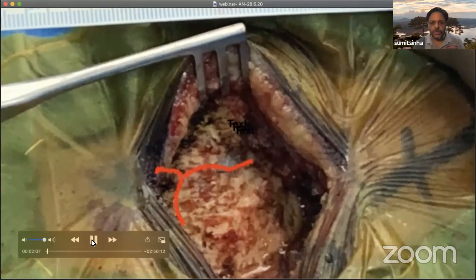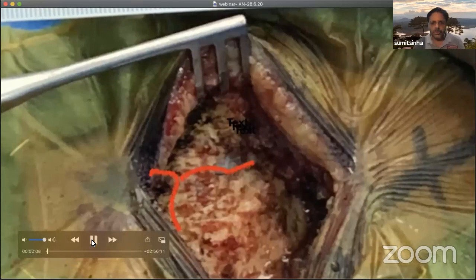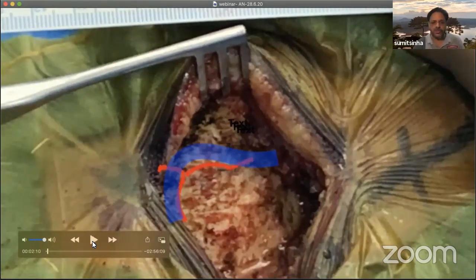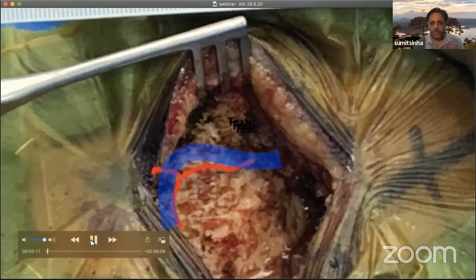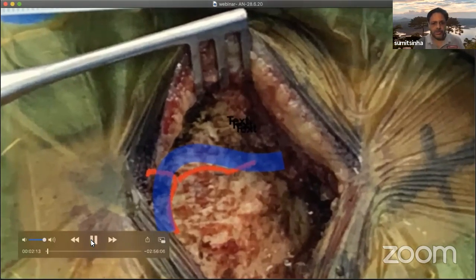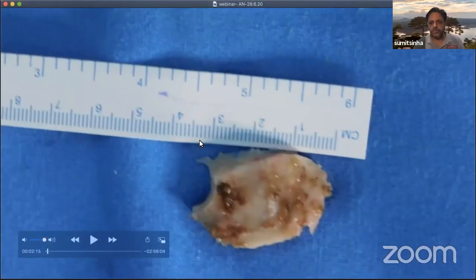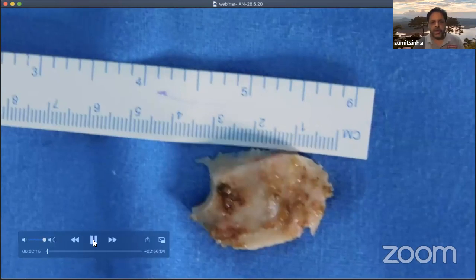So this is the location of the sigmoid transverse sinus junction, as you see here, and shortly you will see the craniotomy also. This is the size of the craniotomy. You see that this was almost 3.5 by 2 centimeters in size.